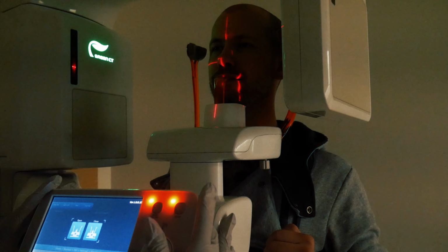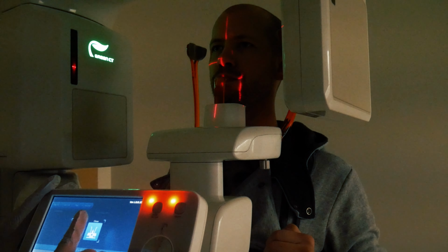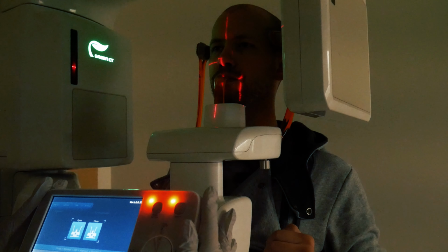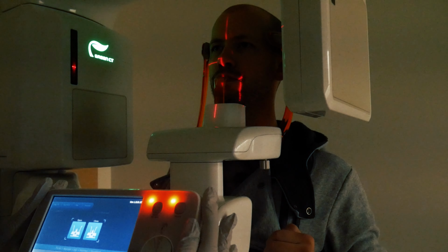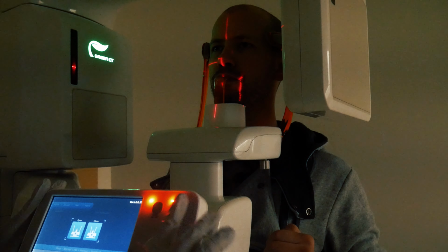Okay, and then close your lips and swallow. Then you're going to close the head holders, which will just hold the patient's head in place. Then you can press this ready button right here, or press it on the computer.